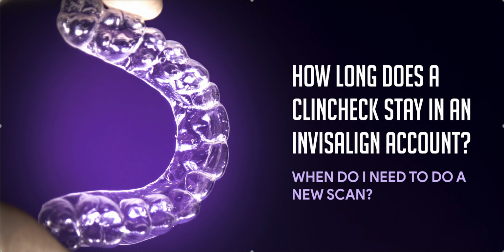That's actually not true. If you have a lot of patients that don't move forward, and if your acceptance rate within your account is low, like 10%, 15%, 20% instead of 90%, they never quite say what it is, but they have the right to charge the doctor for Clin Checks. And the doctor has the right to charge patients for Clin Checks. It's their choice. In our offices, we do 1 complimentary. After that, it's an additional fee. That's just how we do it.